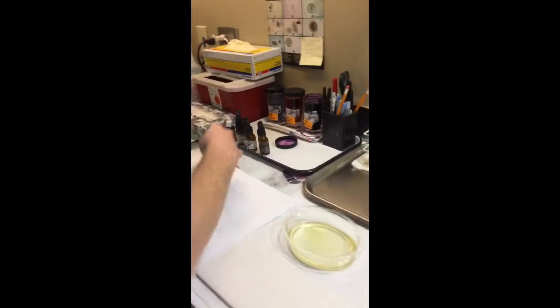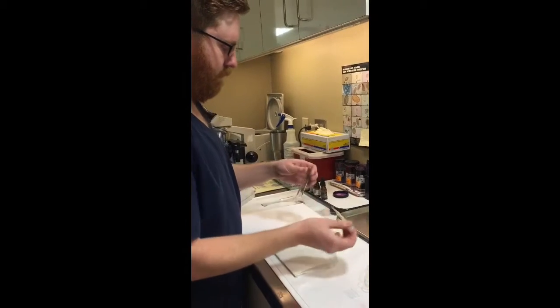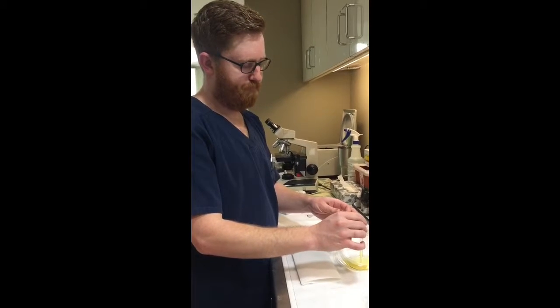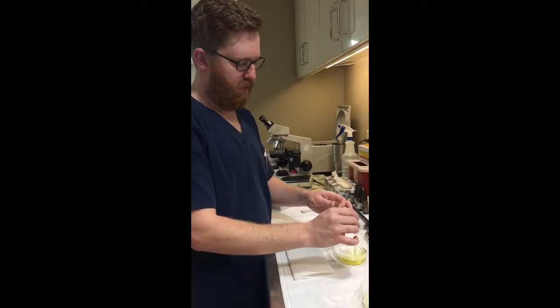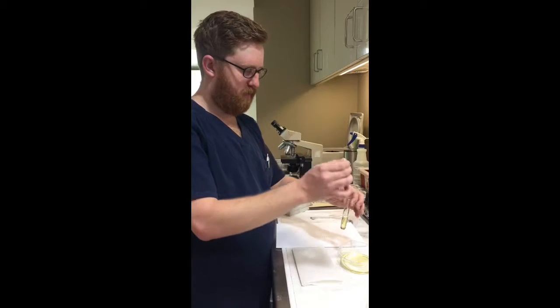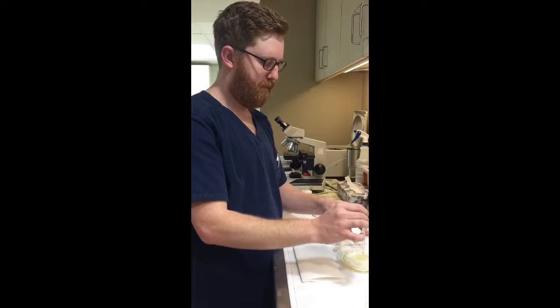And I'll go ahead and get 10 ml of my sample here that I just collected from my dog Sam. I have the tube properly labeled, and I'm just going to fill it up with this clean pipette into this brand new tube. While I'm doing that, I'm going to take a look at the color compared to this white mat and this white piece of paper here. It is pretty dilute, which is kind of surprising to me, so I'm interested to see what we're going to see here.